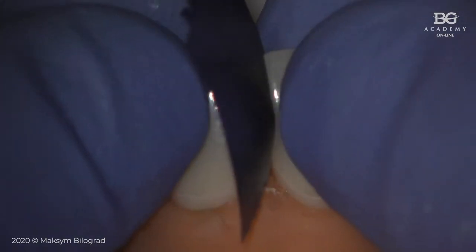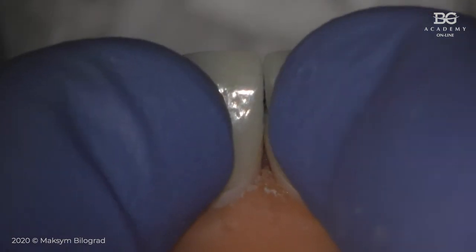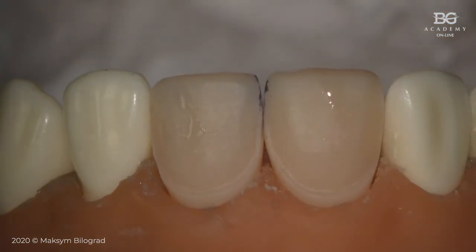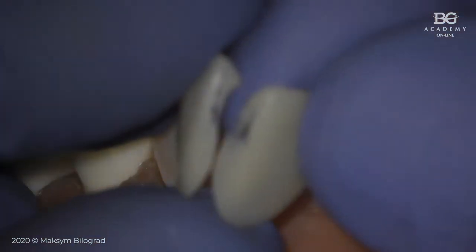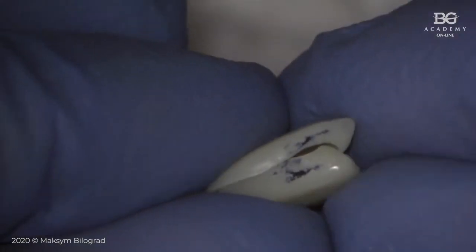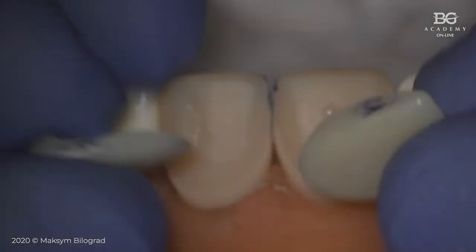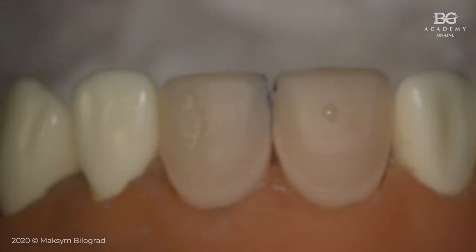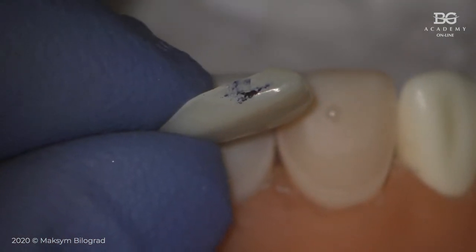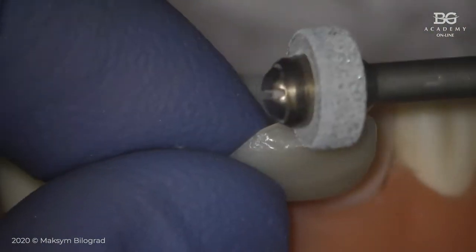Okay, don't push, just a little bit. Then you take your articulator paper out, and you will be able to see these tight areas of the interproximal zone. If you have these supra contacts, you can make some adjustments. To make these adjustments, you have to utilize special rubbers for ceramic. Your dental technician may provide you with rubbers like these, and you just make some adjustments.